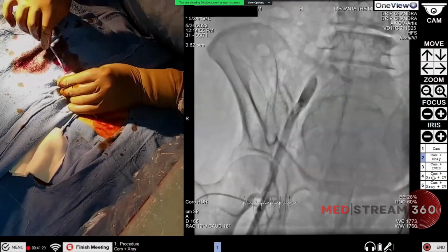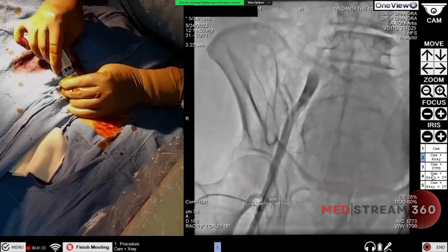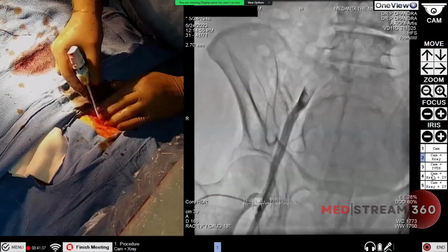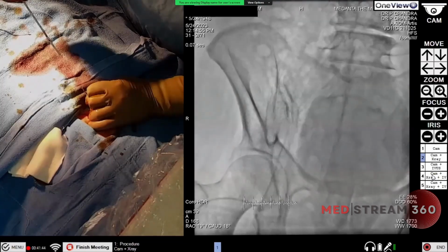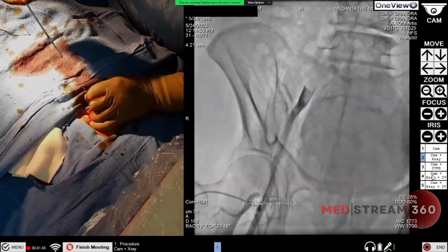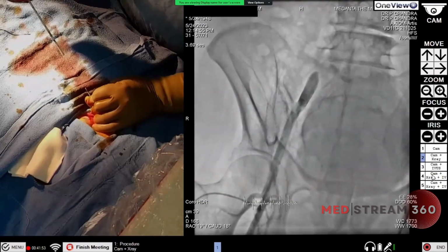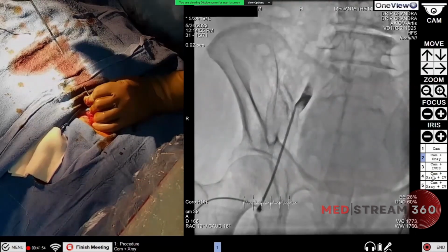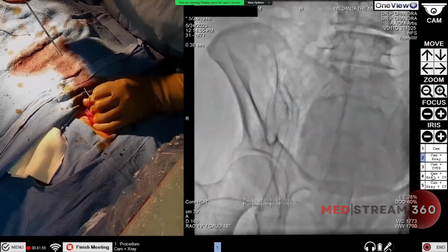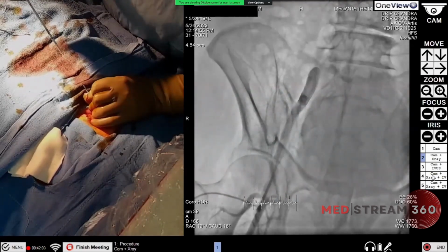And now this is the plug, goes inside, and then we have to get 2 clicks done. So some push and pull. So pushing this small blue tube distally, and pulling the whole thing back, so that the coagulation will happen. We'll give it 30 seconds, and that should be done.